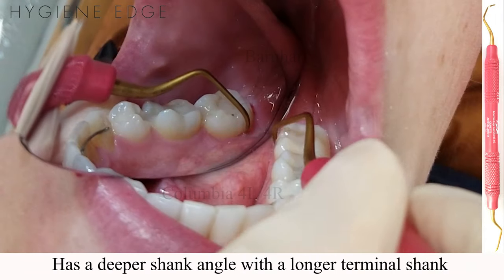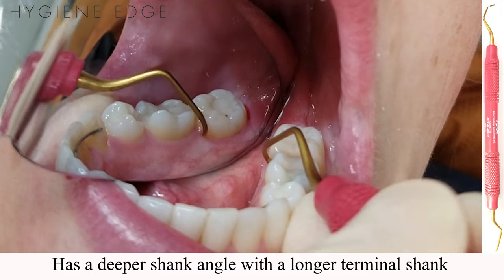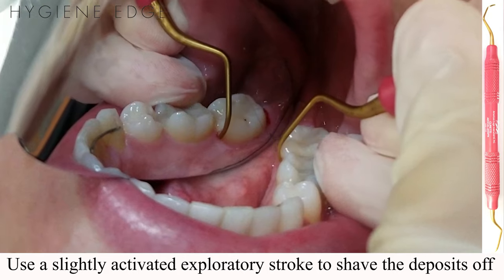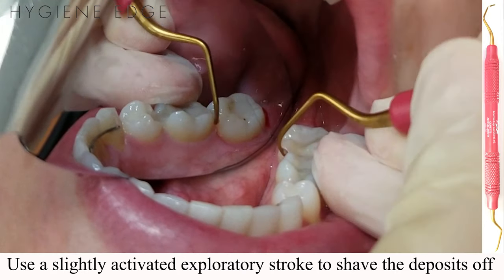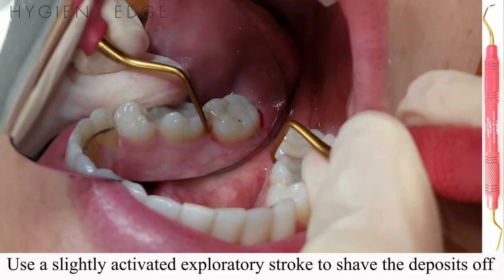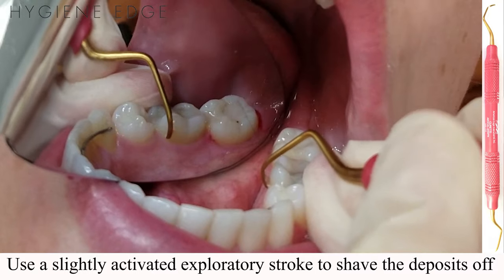This design makes it easier to access areas of clinical attachment loss with light to heavy sub or supragingival deposits. To remove deposits, gain a 70–80 degree angle, and with the XP Sharpen Free technology, you'll then remove the deposits with a lighter, slightly activated exploratory stroke, and shave the deposit from the top to tooth surface until it's removed.